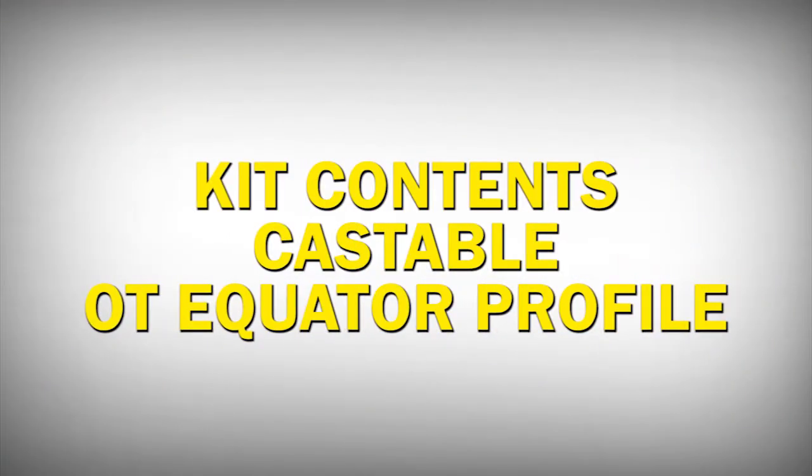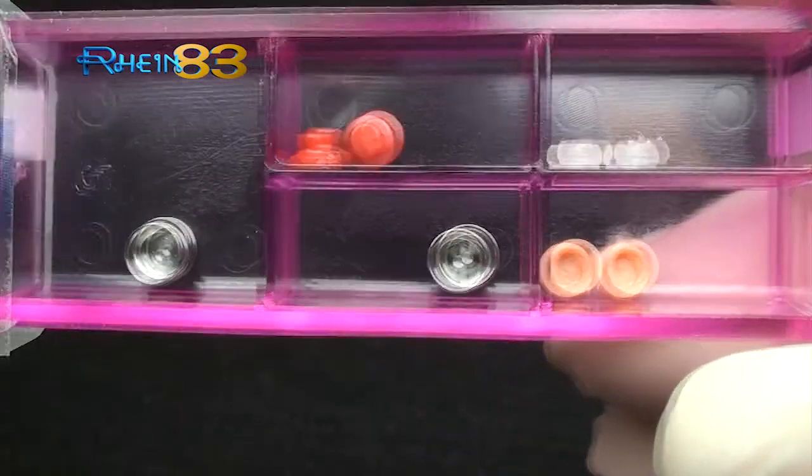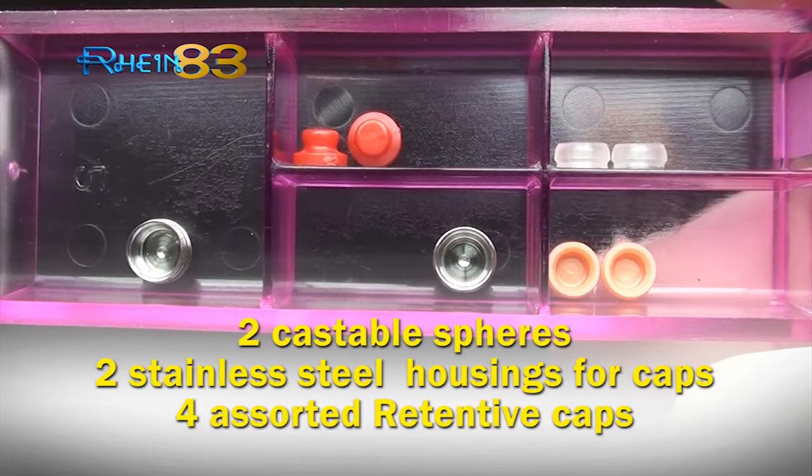Kit contents — Castable OT Equator Profile: two castable spheres, two stainless steel casings for caps, four assorted retentive caps — two soft, two standard.